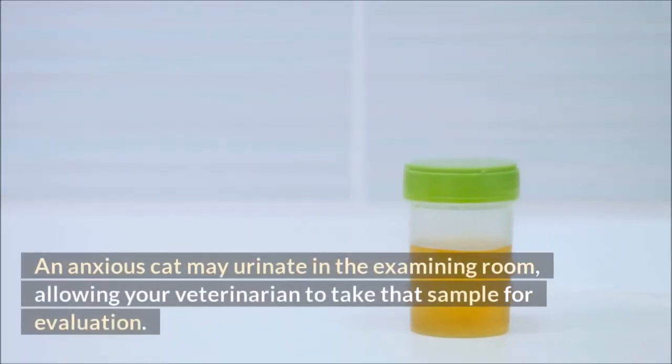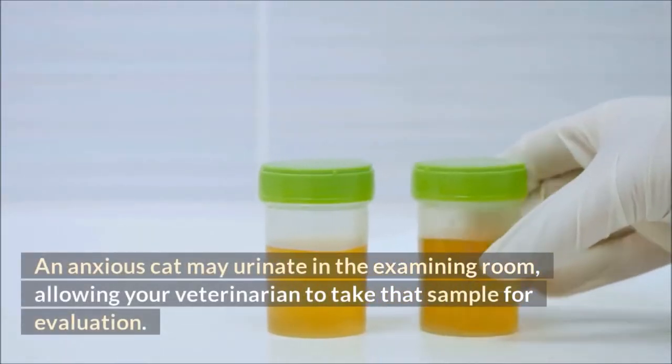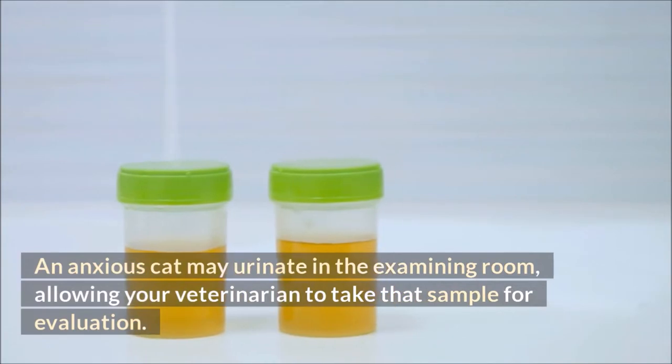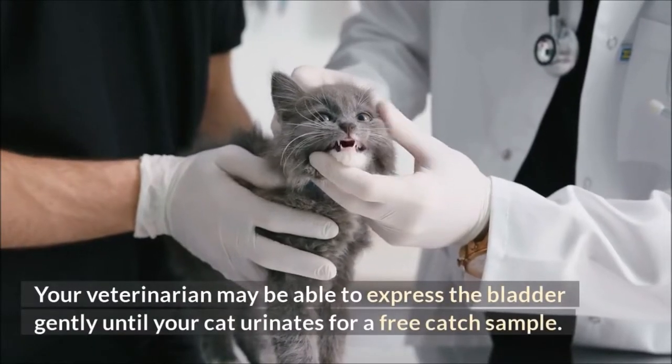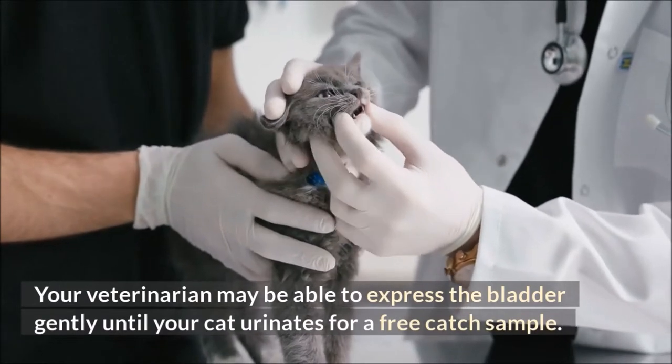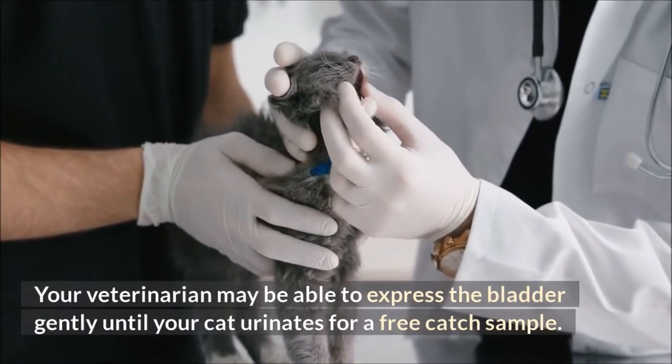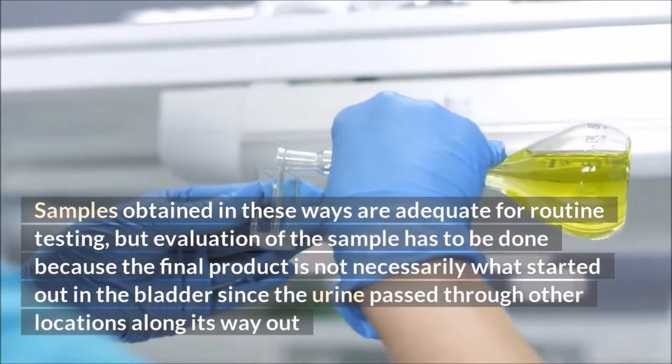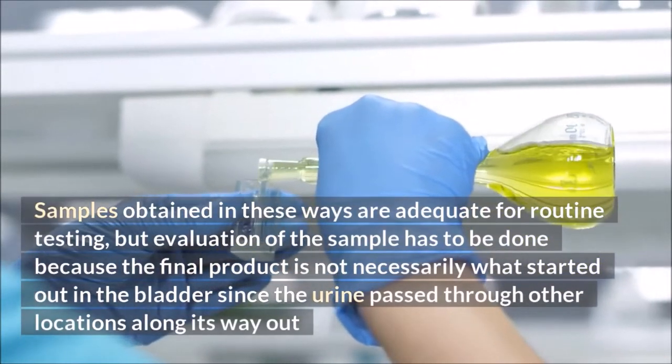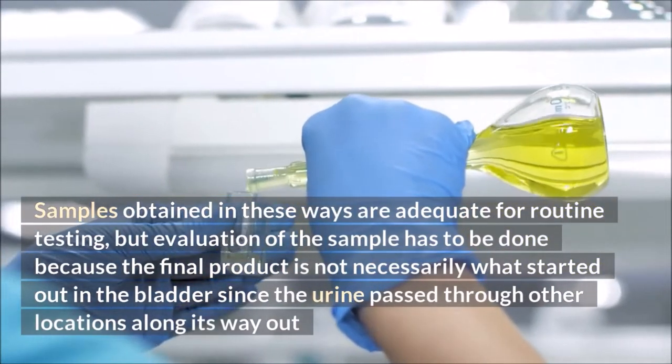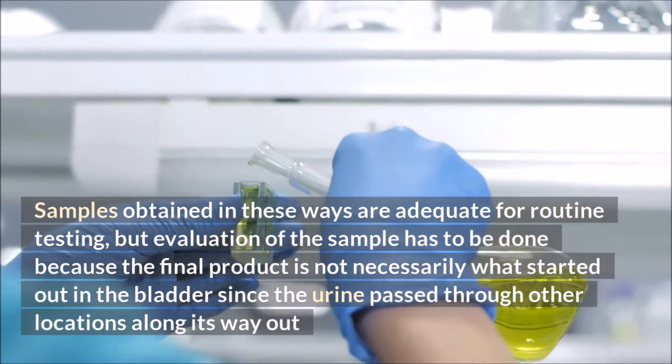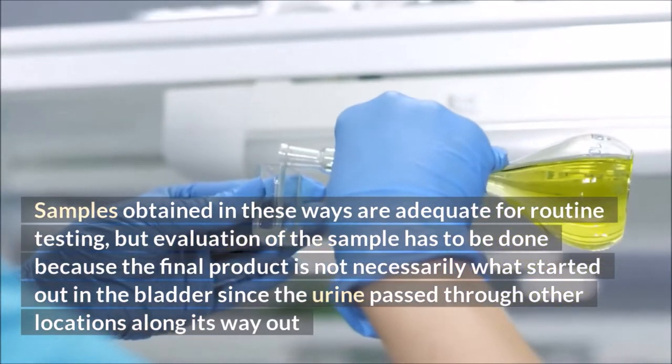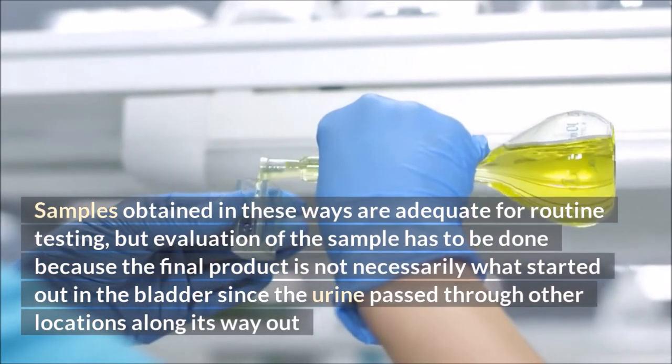An anxious cat may urinate in the examining room, allowing your veterinarian to take that sample for evaluation. Your veterinarian may be able to express the bladder gently until your cat urinates for a free catch sample. Samples obtained in these ways are adequate for routine testing, but evaluation of the sample has to be done because the final product is not necessarily what started out in the bladder, since the urine passed through other locations along its way out.